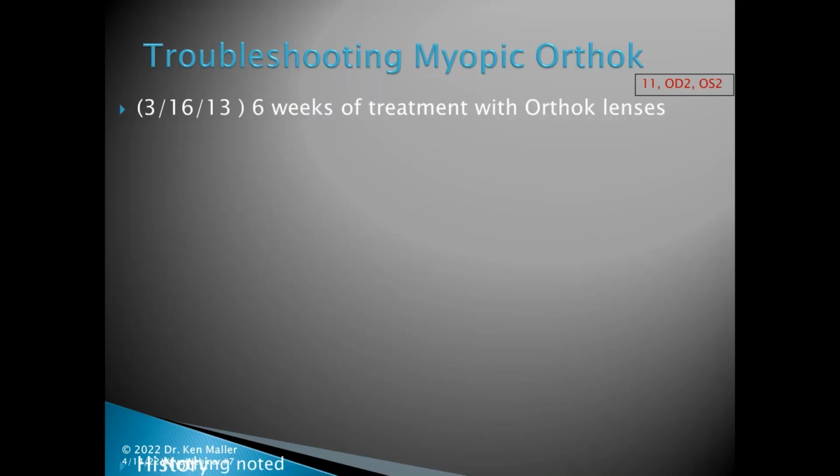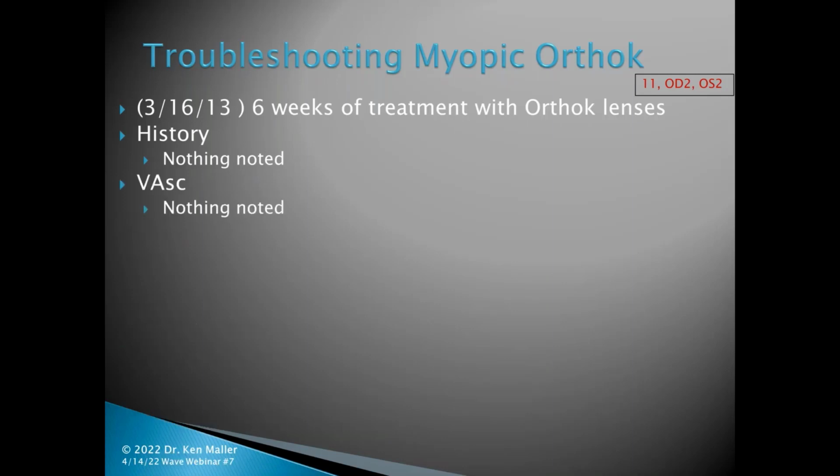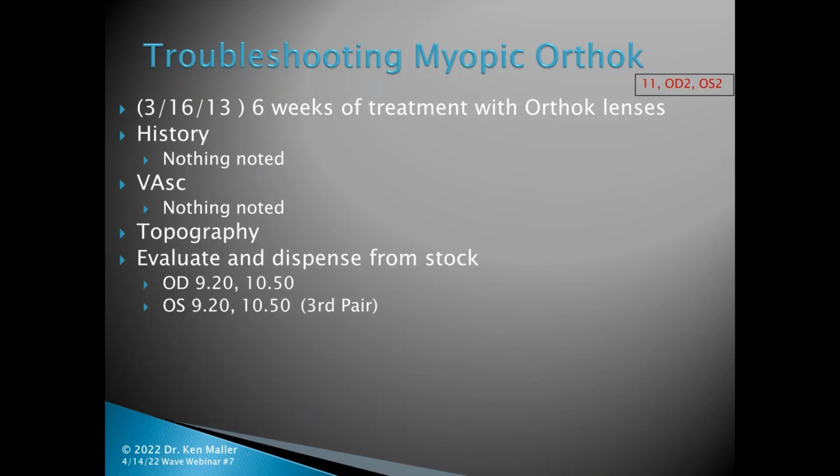So at his 11th visit, he's still on OD number 2 and OS number 2. The history, nothing was noted. No uncorrected acuity was measured. Topography was taken that day, and they evaluated these lenses from stock.